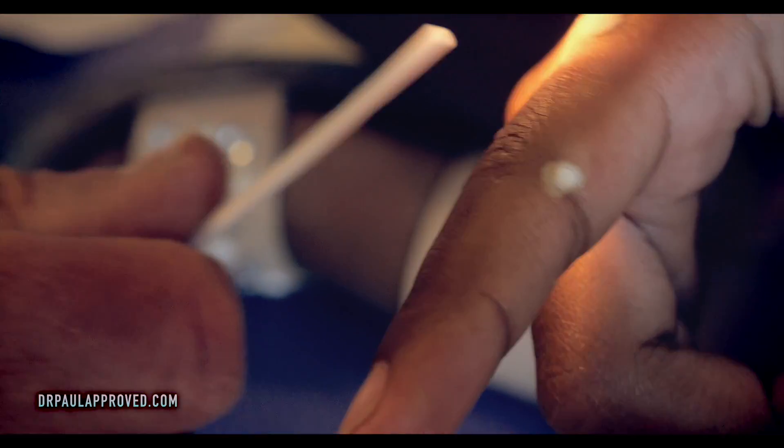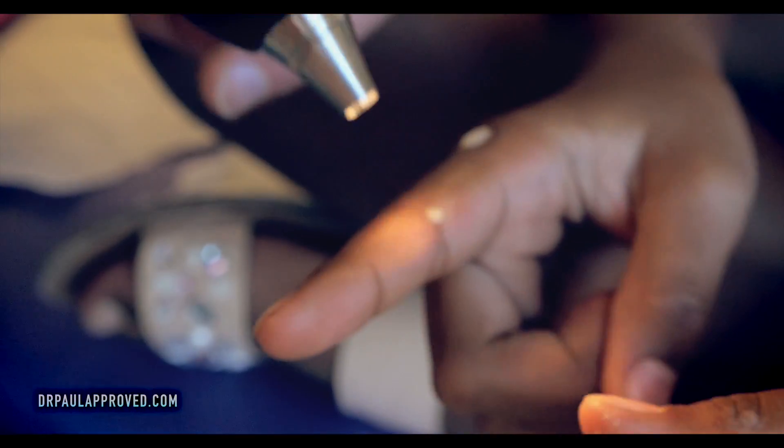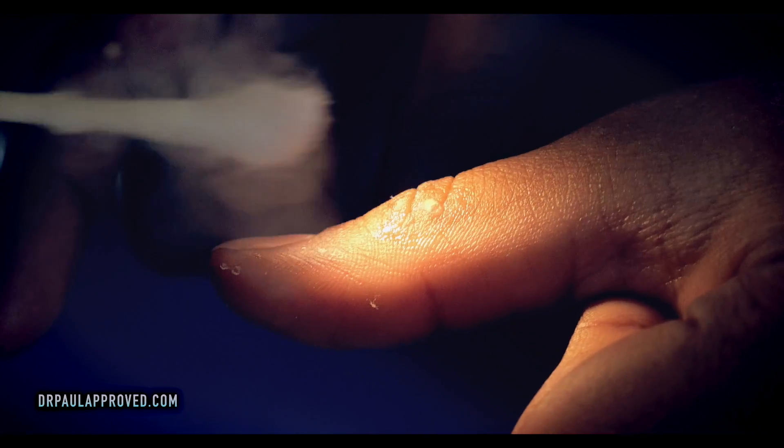You can see that one starting to thaw. It's just the wart that's left. It stings really bad, but they do sting even after we're done doing it. And then your other one's right there — is that about it? Yeah.